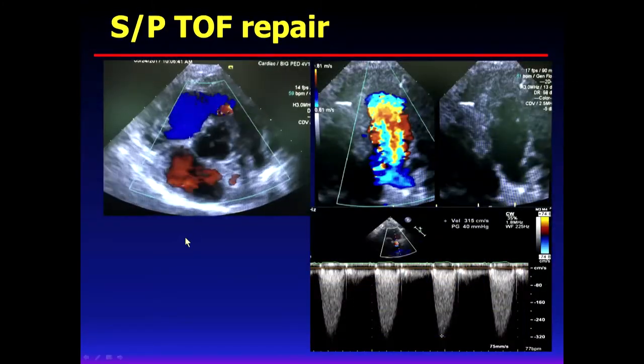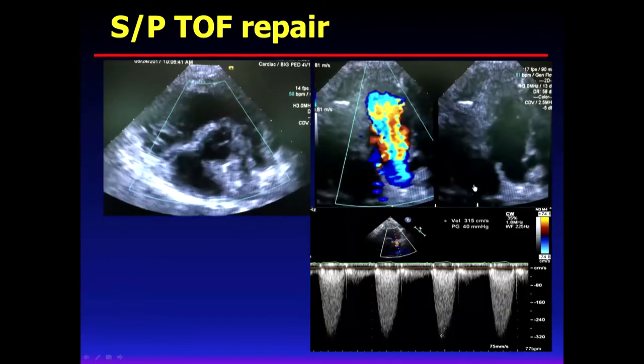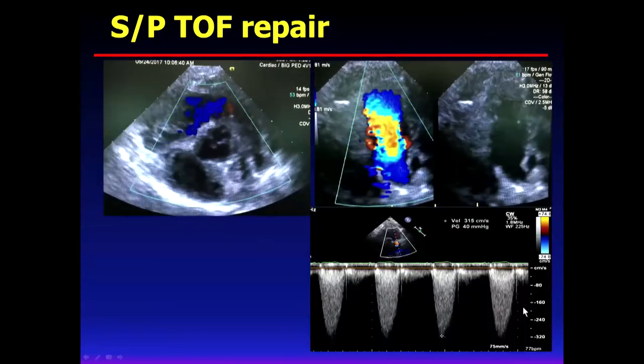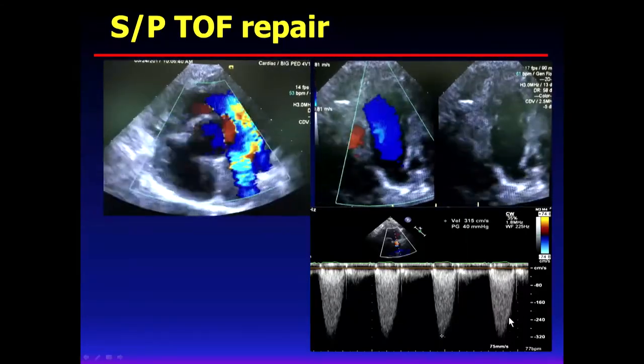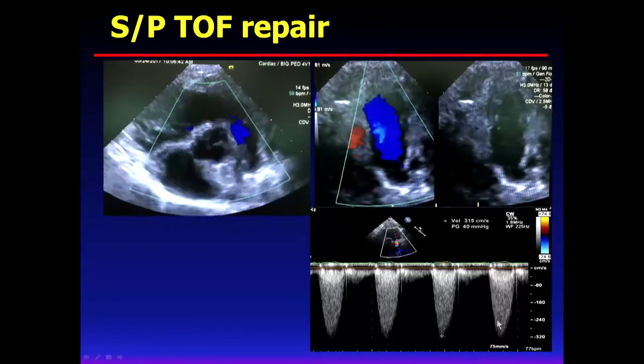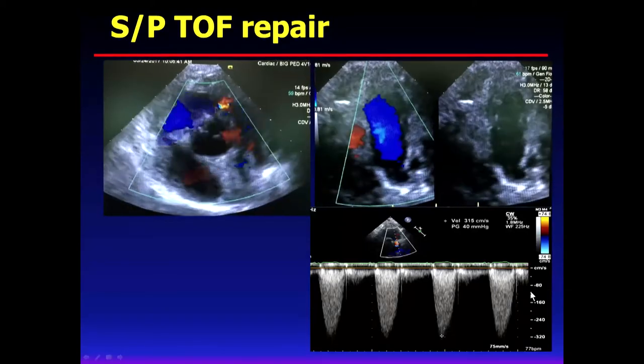And this is another patient with pulmonary stenosis, and pulmonary regurgitation has already happened. In this kind of case, we need to look at the RV volume and size all the time. And if the guideline fits, we need to reopen or do an intervention for the pulmonary artery.